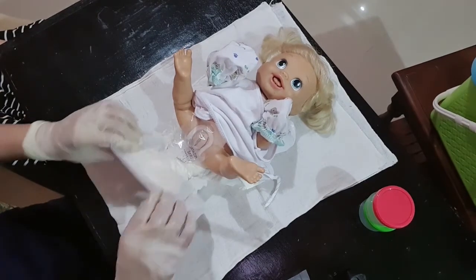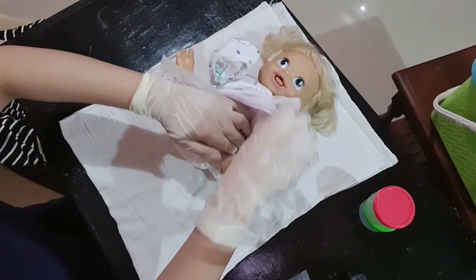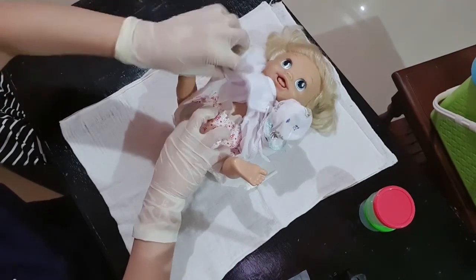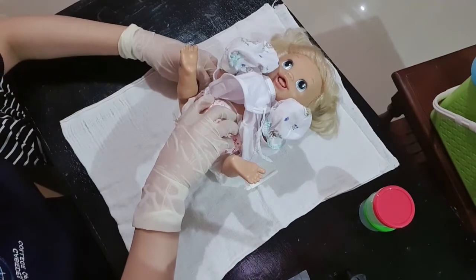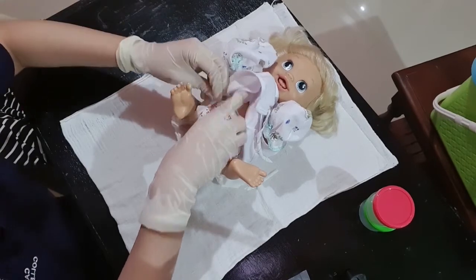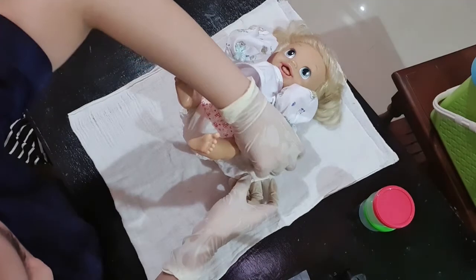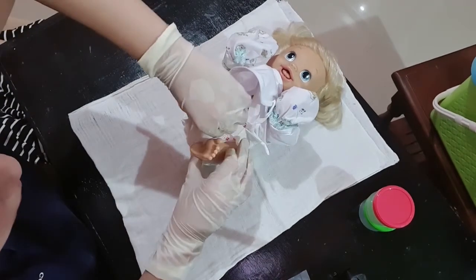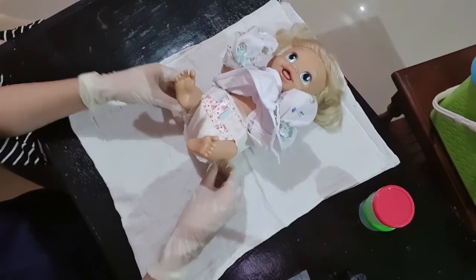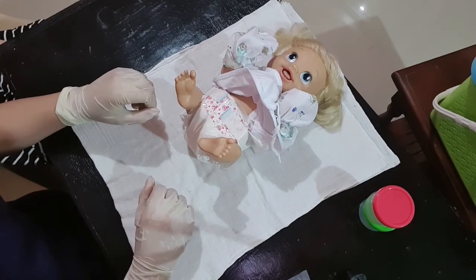Then, I will now be putting the diaper, making sure that it is not too tight. Rationale, this is to avoid the urine from leaking.